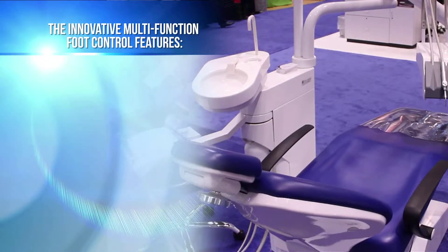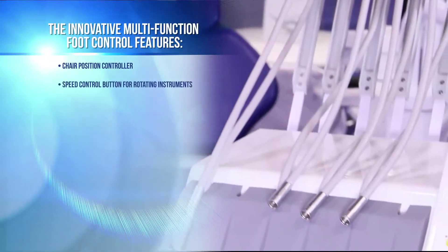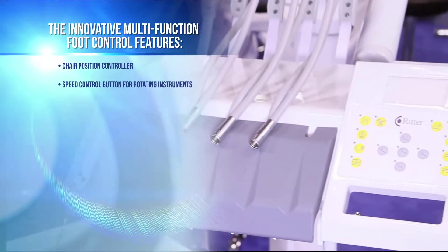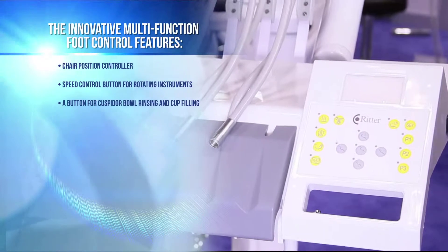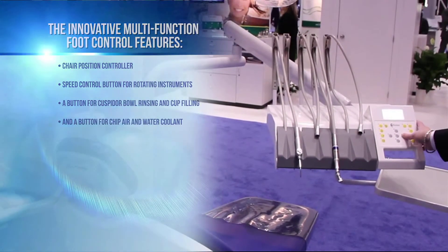The innovative multifunction foot control features a chair position controller, a speed control button for rotating instruments, a button for cuspidor bowl rinsing and cup filling, and a button for chip air and water coolant.